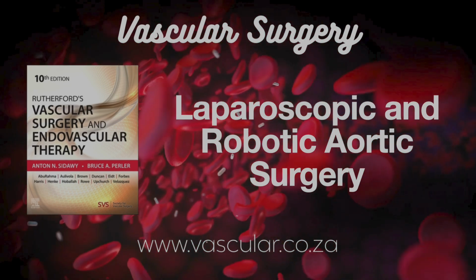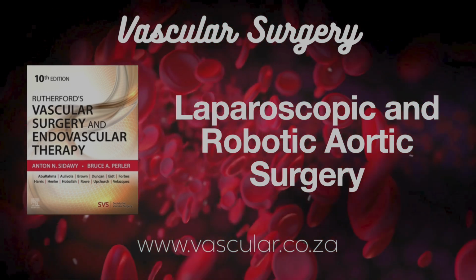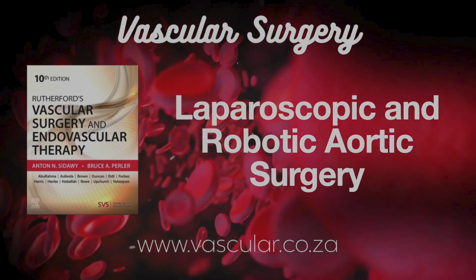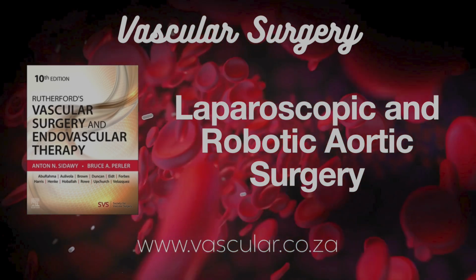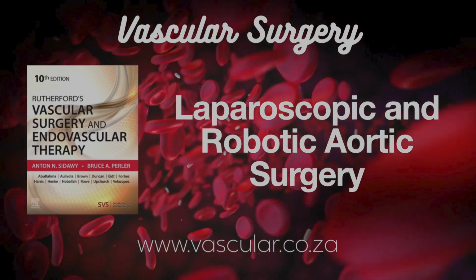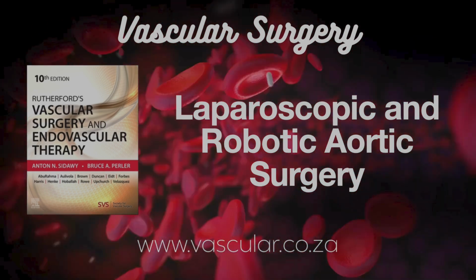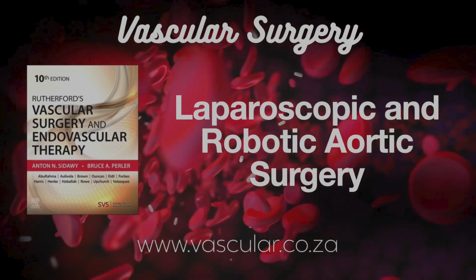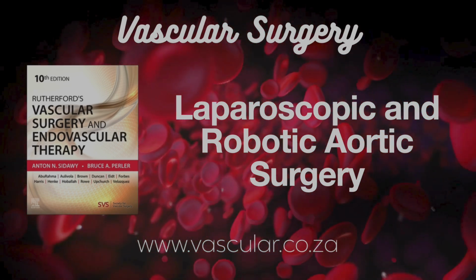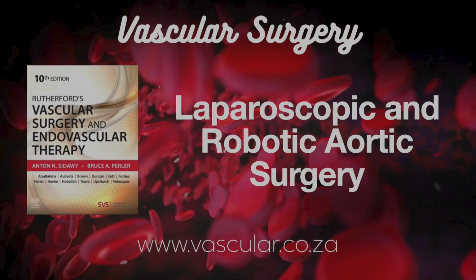The book also mentions robot-assisted surgery. How's that different from totally robotic? Robot-assisted means the robot isn't doing the whole thing. It's used for specific, usually the most demanding parts. Like the sewing. Exactly. Often the anastomosis. Maybe the initial exposure is done laparoscopically, then a small incision, a mini laparotomy, is made to put the graft in, and then the robot is brought in just for the precision sewing. So, using the robot strategically for its strengths. Precisely. Leverage its advantages for the trickiest bits, maybe save some clamp time on the aorta.